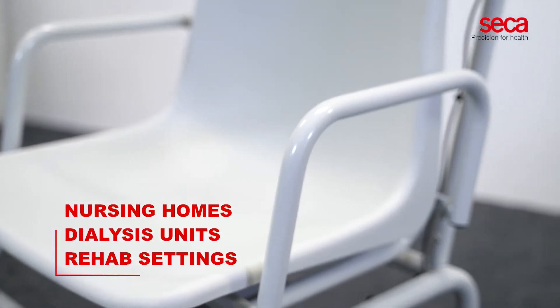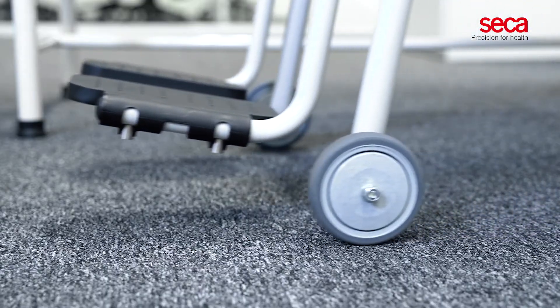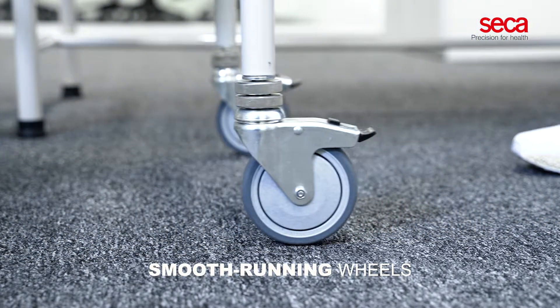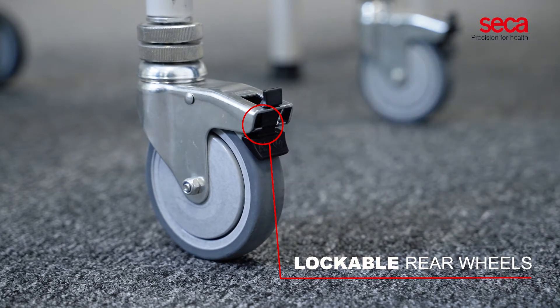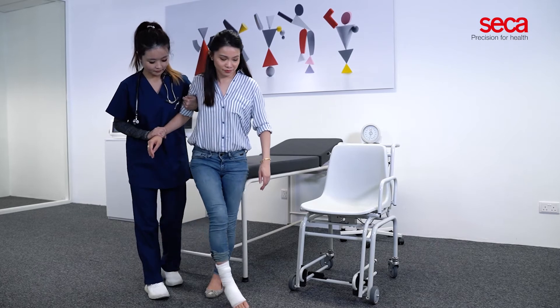The unique design allows you to bring the scale directly to patients who are bedridden or less mobile. The smooth running wheels ensure effortless mobility, and the lockable rear wheels of the Sika 954 ensure the patient's safety while they are sitting down and standing up.